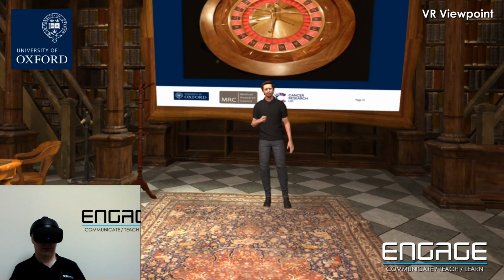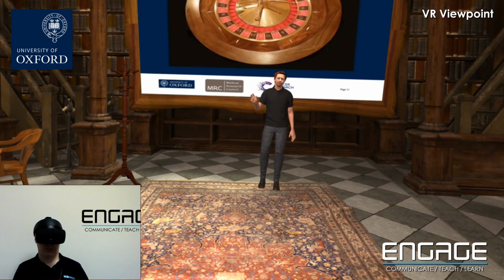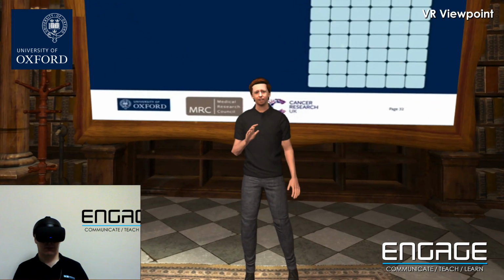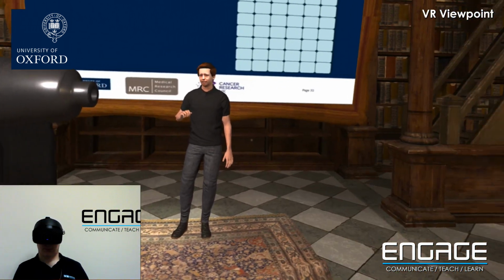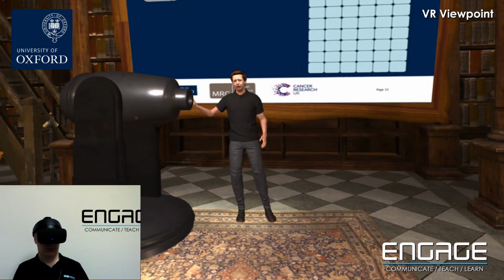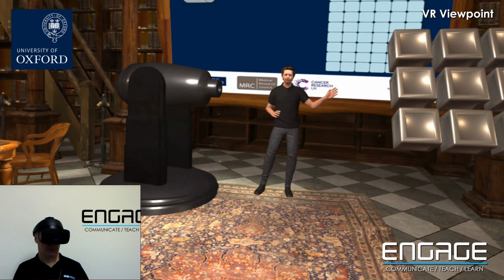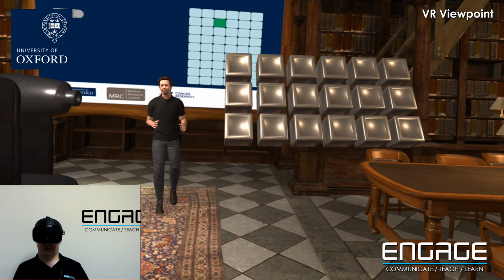You can't. But I could program a computer to understand not where one photon, where one little cannonball will go, but I can ask it where 2 or 3 billion cannonballs will go. And that, just like rolling this wheel 37 million times, I can get a pattern of where all those little cannonballs will go. So let's fire this gun. Let's do this experiment. This is what we would do in reality. We get a computer to simulate, to roll the wheel several million times. And the analogy with roulette is so close that this is called Monte Carlo modeling.